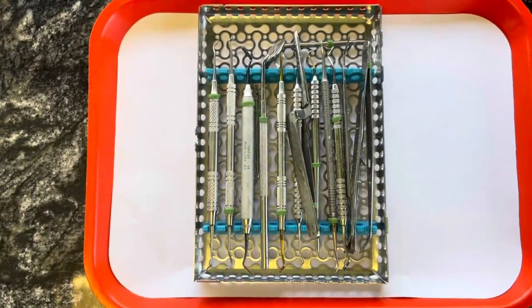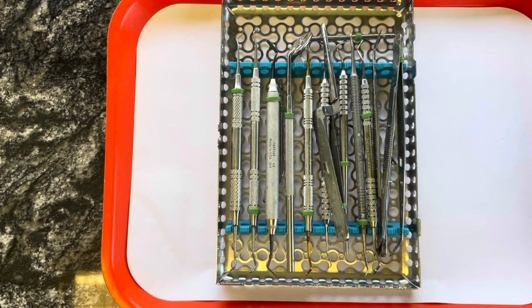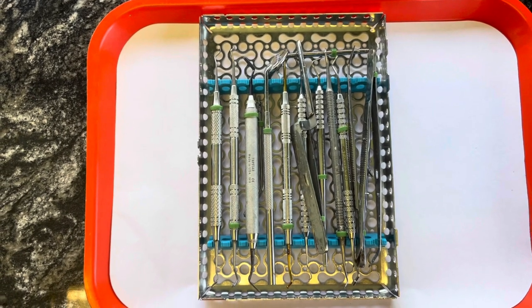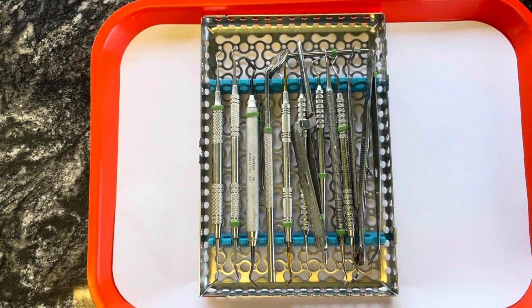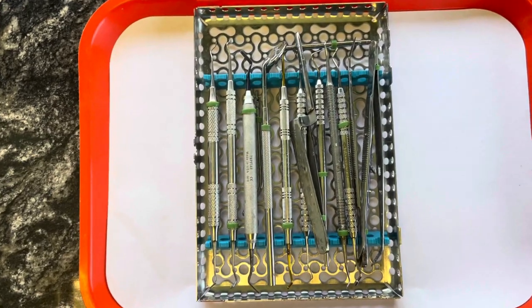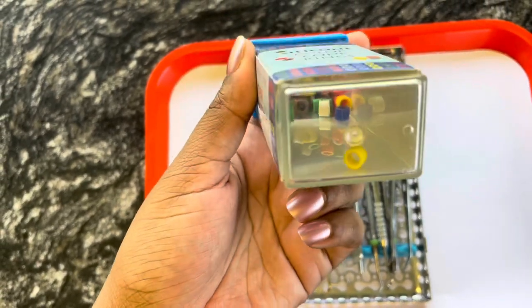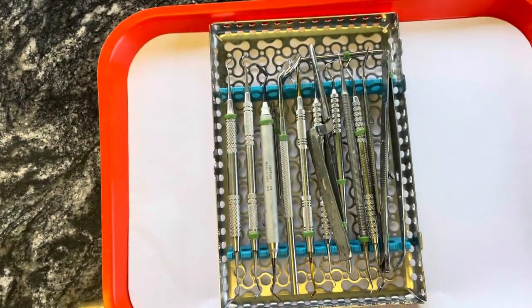So all of our instruments have this color on it. They have different colors, but we keep the same color in one cassette so that none of the instruments are misplaced. We all know where they go — they're all color coordinated. So if an instrument is misplaced or happens to fall out of the cassette during sterilization, you would know that the green goes with green. They're called silicone color code rings and they have a bunch of different colors. So you just choose one color for each cassette, that way you can keep them organized.